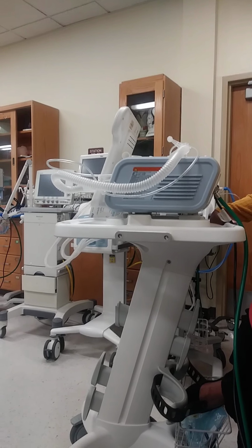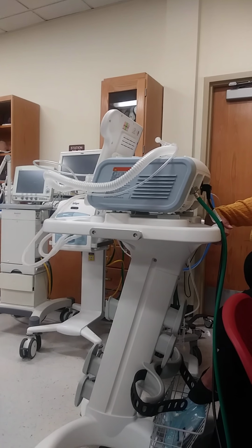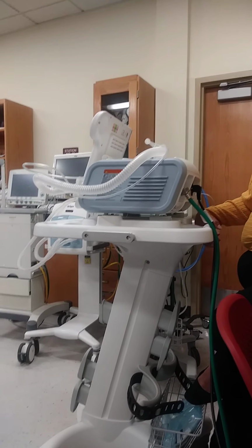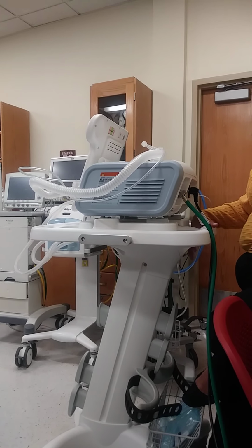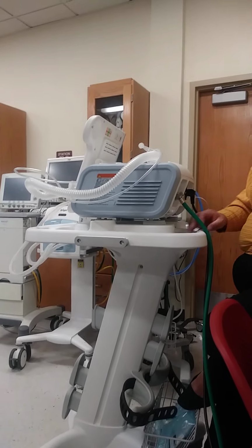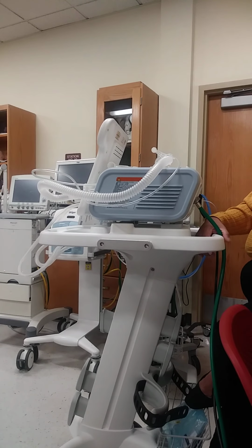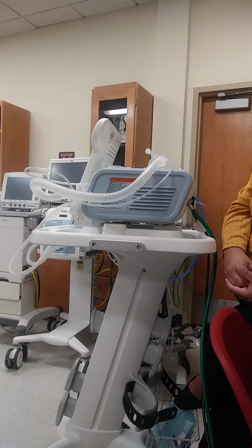So the indications would be patients breathing spontaneously, and sleep apnea patients. Indications can be a lot of different things. One of the big indications is acute respiratory distress, acute exacerbations of COPD, and acute ventilatory failure. These are issues where somebody has trouble breathing, and whatever we did with oxygen devices is not working. Any type of respiratory distress that acutely happened, we use it for COPD, and for patients who have left heart failure, we call it CHF. So that's an indication.